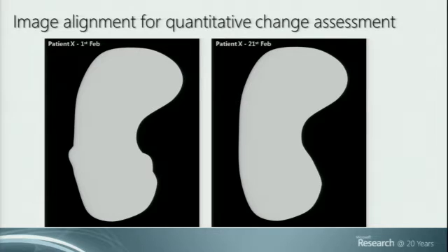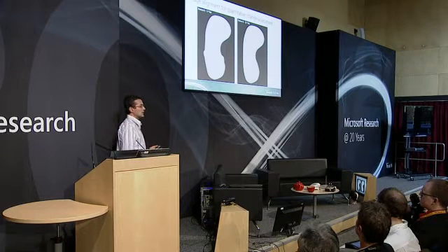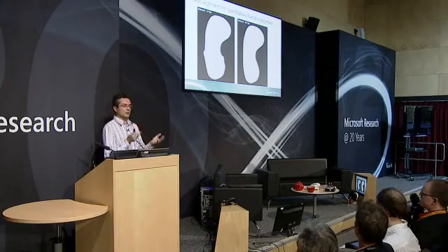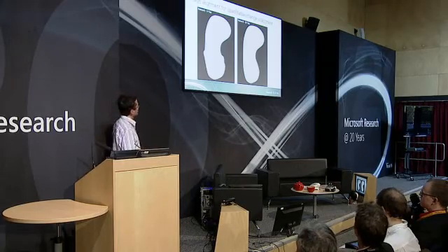How can we isolate the normal physiological changes from the abnormal ones, which are perhaps due to an anomalous deformation of some organ, or the growth of a lesion, and so on? So I'm illustrating this with a toy example. It's just an illustrative example.